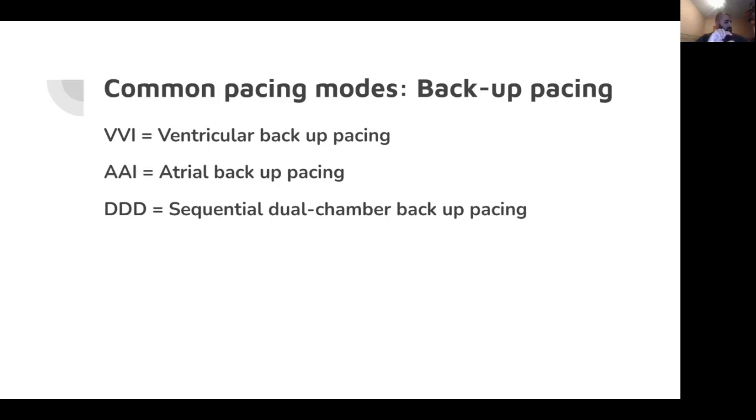So we may set the pacing box to VVI 80. If we set the pacing box to VVI 80, then the pacing box will read the information, and if it finds that the QRS depolarization rate is, let's say, 60, it will then kick in and start trying to pace the ventricles by delivering a small electrical stimulus via the pacing wires that are stitched into the ventricular wall to try and elicit a response from the ventricles.